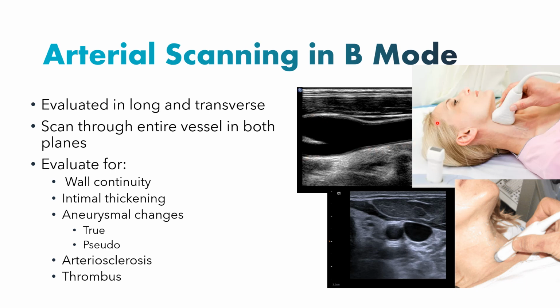When you have things like nicotine use or diabetes, hypertension, or other vascular diseases, that's when you're going to start seeing the initial forms of plaque buildup, which usually start out at a bifurcation, and it's usually due to a roughening up of the wall. So by paying close attention to the tunica intima, you can really assess for any early changes in that vessel.